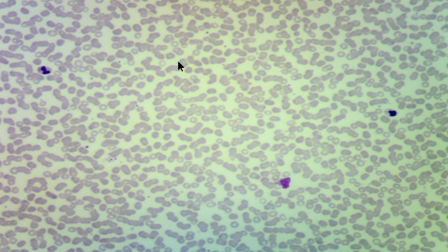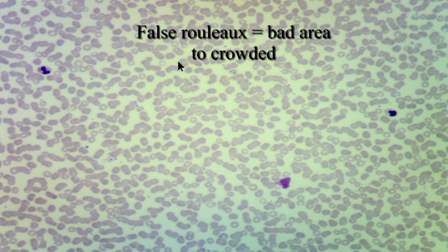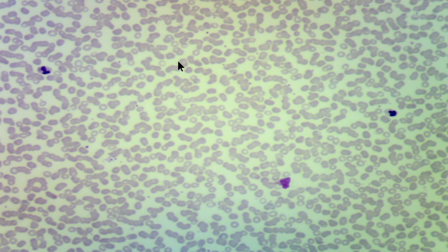This phenomenon is referred to as a rouleaux, but you have to be very careful about rouleaux because even in normal smears, you would be able to observe rouleaux if you go deep into the crowded area of the slide. So we cannot consider this a rouleaux and we should not report it until we are able to confirm that this is indeed truly rouleaux.